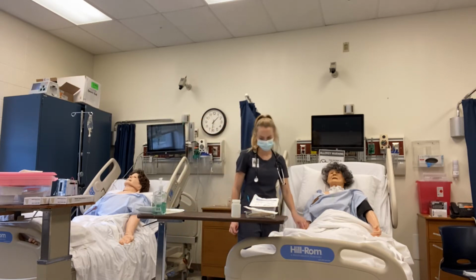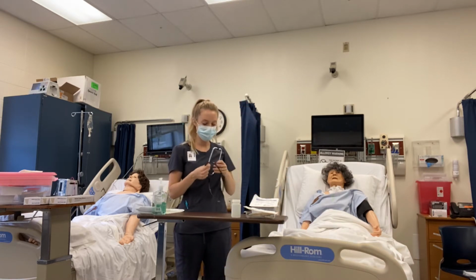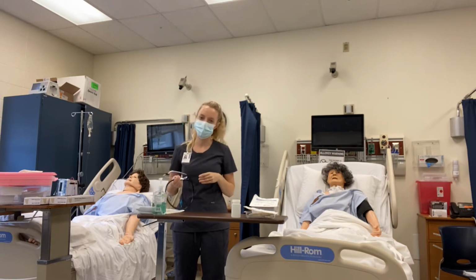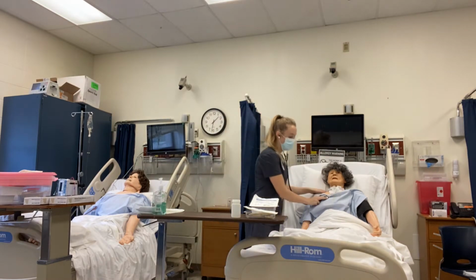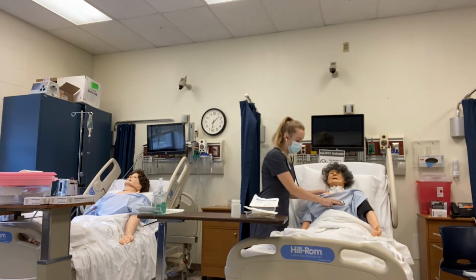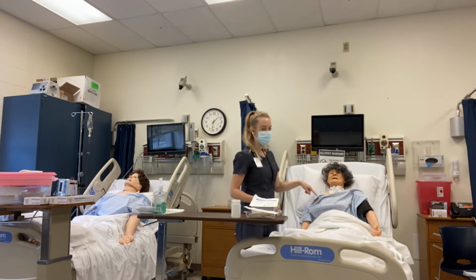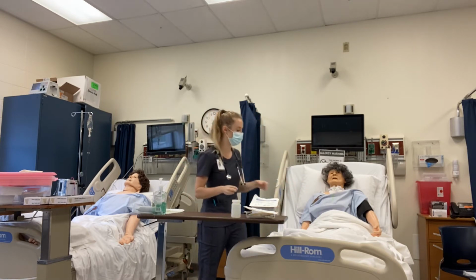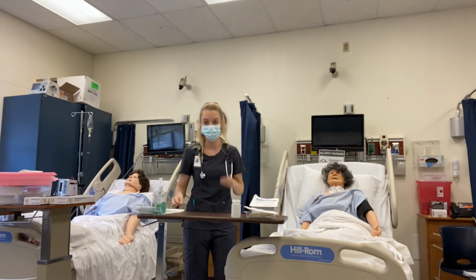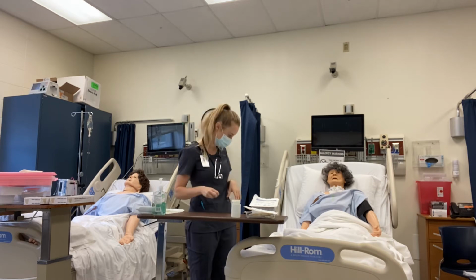Thank you very much. Next, I need to assess Mrs. Jones. I'm going to assess her respiratory status, most importantly. I'm going to be listening to her lungs. I'm going to be assessing the ease of breathing, any shortness of breath, any struggling to intake. I'm going to be looking at the secretions around the tracheostomy tube. And I'm also going to want to grab her blood pressure and her pulse. If any of these are elevated, it could indicate respiratory distress.